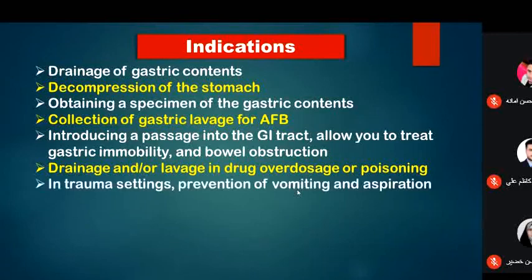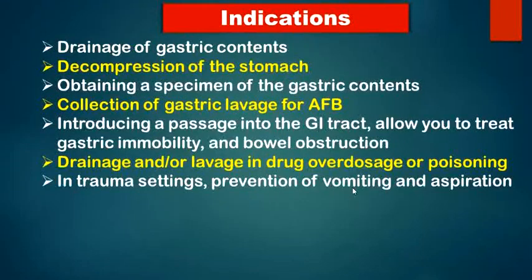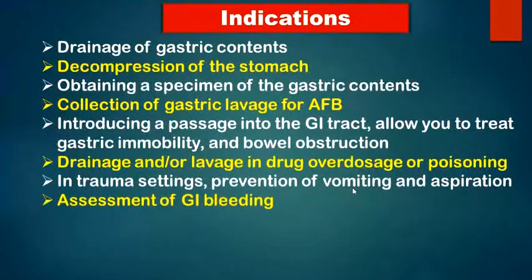In trauma, the patient has a trauma, and we need to avoid vomiting and aspiration, so we put in the NG tube. Assessment of GI bleeding. The patient has GI bleeding, and we need to get a real assessment of the amount.